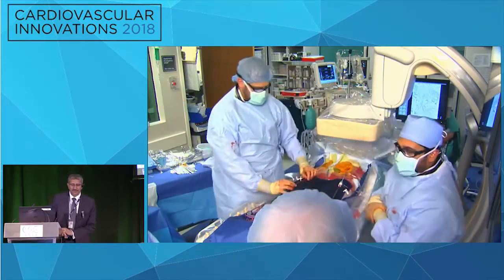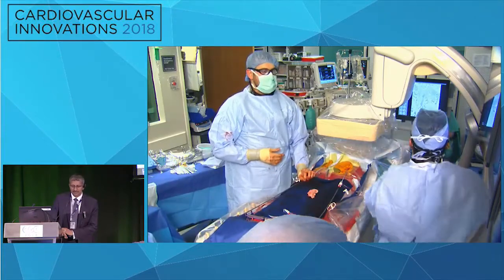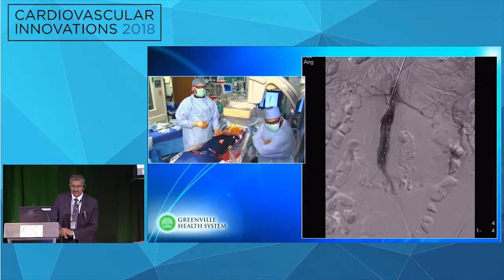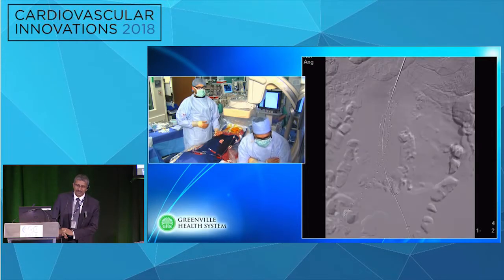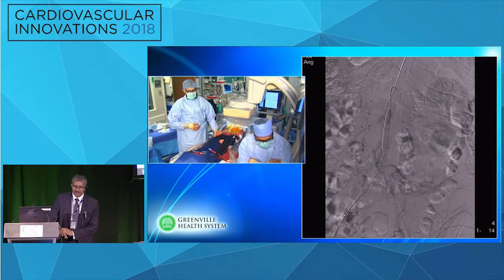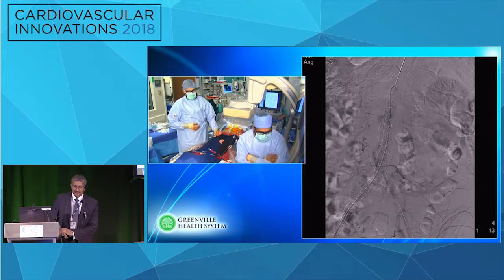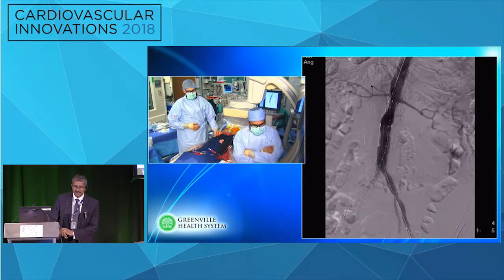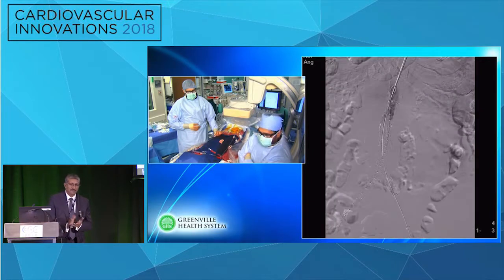Okay, great. Well, guys, we just wanted to show you our completion imaging after we've ballooned everything. If you look at the final images there, it looks like we've landed the left renal very well. We've landed both hypogastrics well, and everything looks good. No evidence of endoleak that we see there. And now we just close the groins up. Thank you again. Great job.